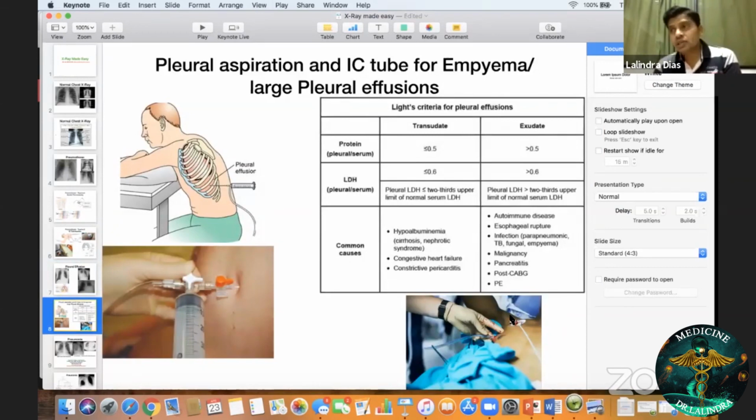Then also we did some theory on pleural effusions. We have actually covered pleural effusions completely for you, ERPM part A, B, C, all three categories. So when you get a chest X-ray, how do you interpret that? So you will see obliteration of the costophrenic angle, and also there's increased whiteness, which is suggestive of pleural effusion, increased whiteness in the X-ray.